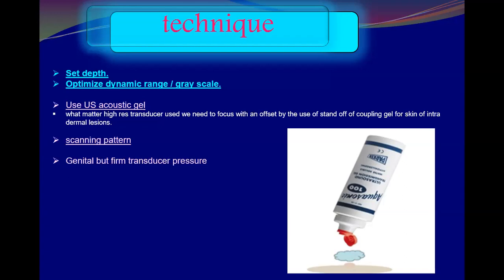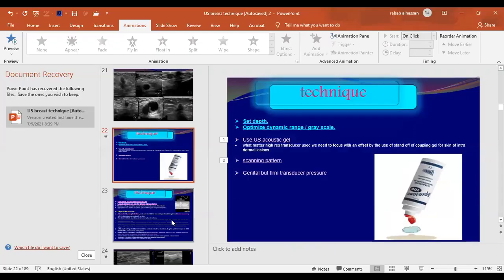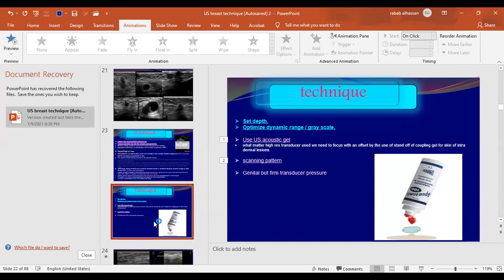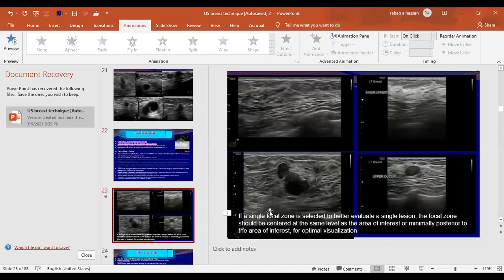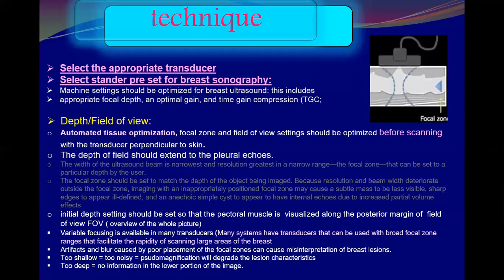First of all, we have to select the appropriate transducer for the breast examination.